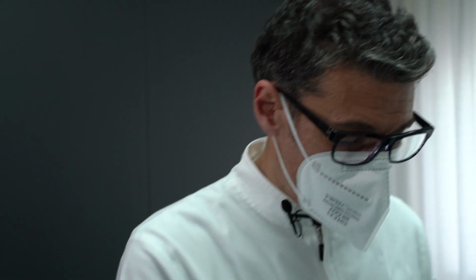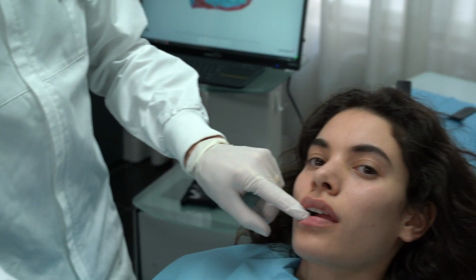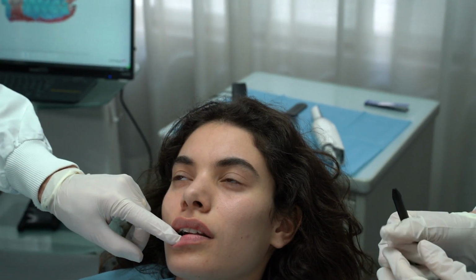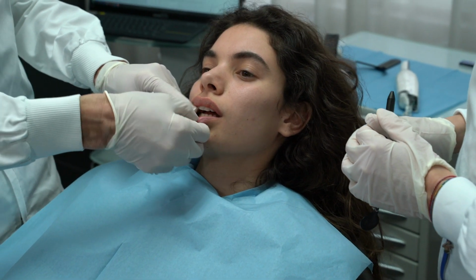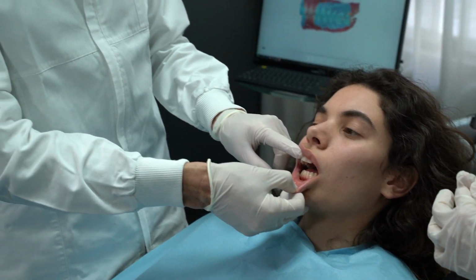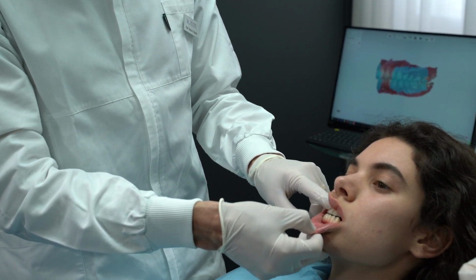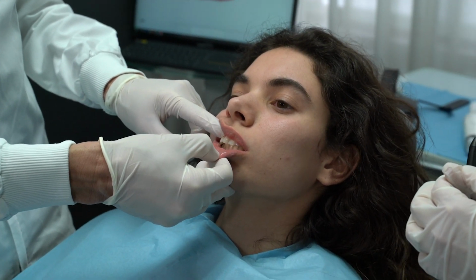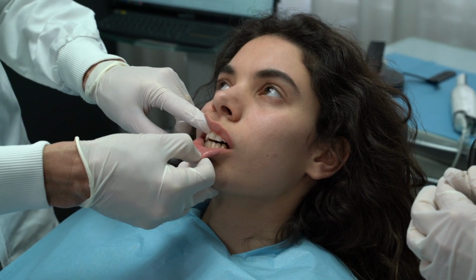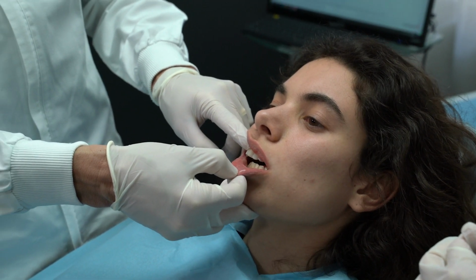So we explained that the mandible basically moves through three major movements that are the ones that we should go to detect. So the mandible can slide forward, it goes back, it can slide to the right, comes back, and it can slide left and comes back.